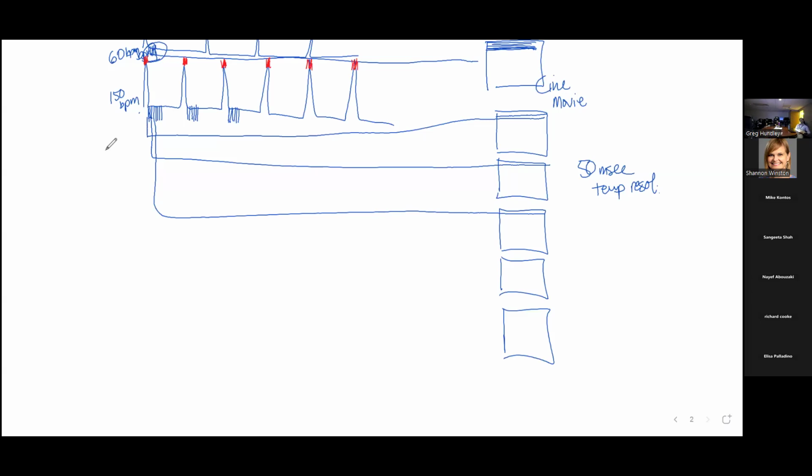If the scanner sees this QRS trigger and this one appropriately, then you're in great shape because it can reorganize all the information that it is gathering. But if some of the triggers, for different reasons, fall in here or in here, that's one of the causes of blurry images.